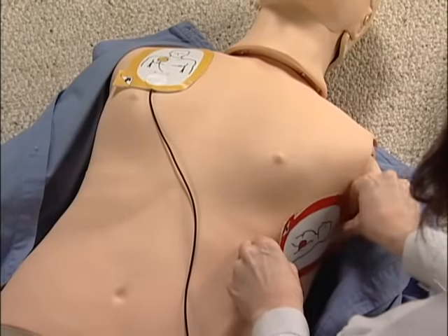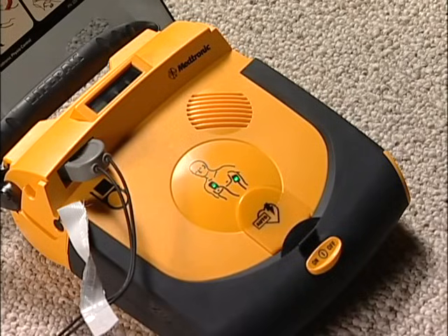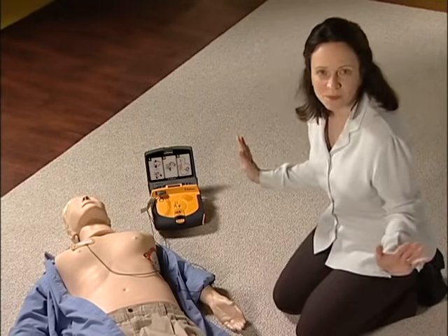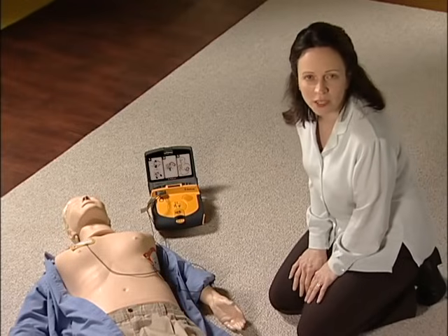As soon as the pads are in place, these lights turn from red to green, and the LifePak AED immediately starts to evaluate the heart rhythm. Do not touch patient. Evaluating heart rhythm. It evaluates the heart rhythm within 11 seconds. Stay clear until it finishes. If you touch the patient or the AED now, you might interfere with the evaluation.